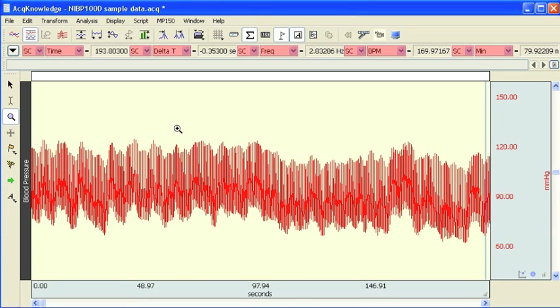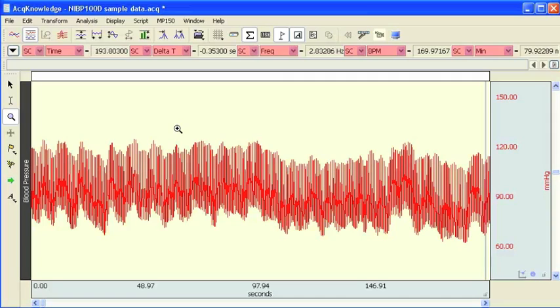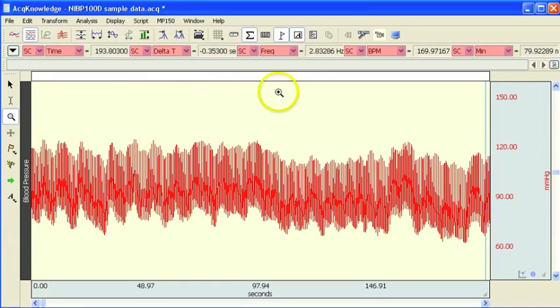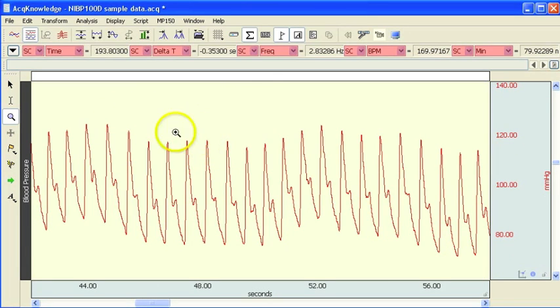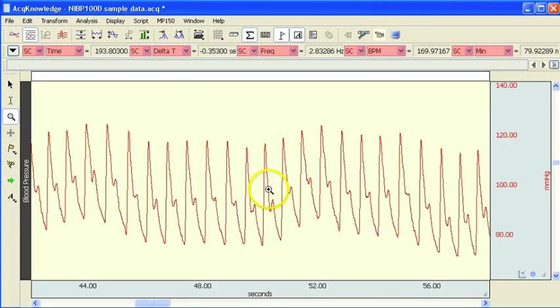That can come either from a direct arterial pressure waveform using a cannula and a TSD104A or from one of the continuous non-invasive blood pressure amplifiers such as the Biopac NIBP100D. This particular waveform came from a Biopac NIBP100D, so this is human data taken non-invasively using the NIBP100D finger cuff sensor.